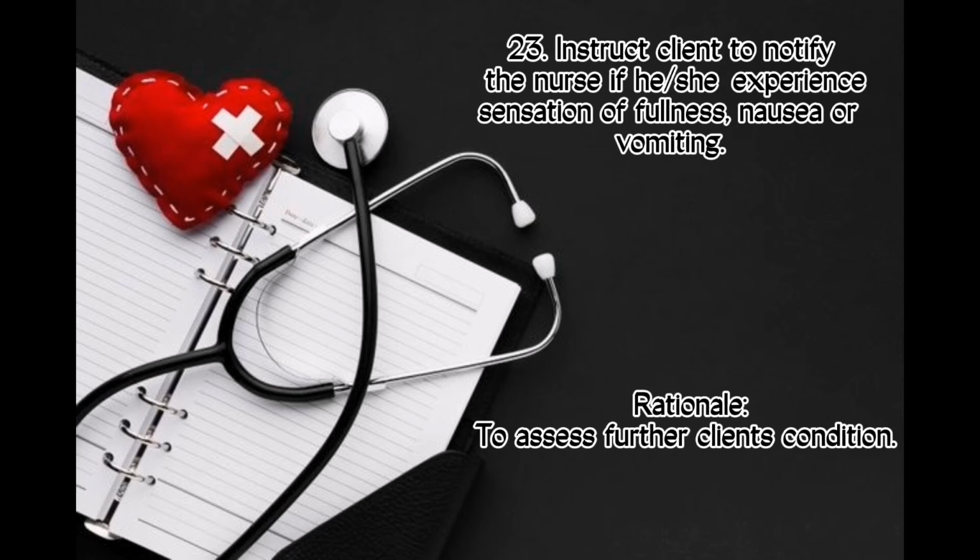The last procedure is to instruct client to notify the nurse if he or she experiences sensation of fullness, nausea, or vomiting. This is to assess further client's condition.